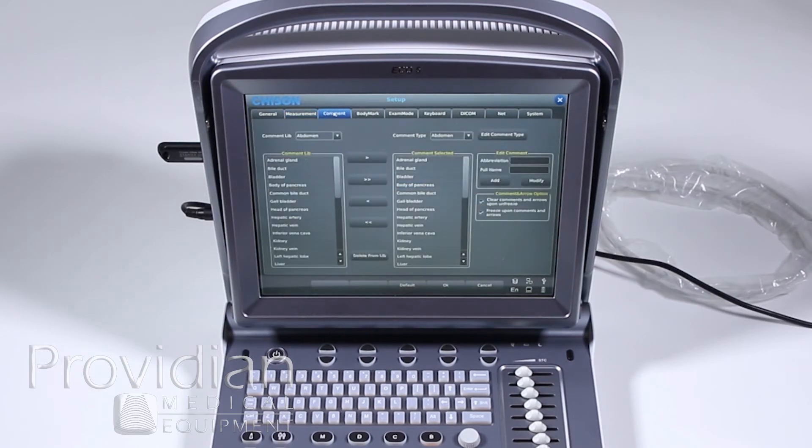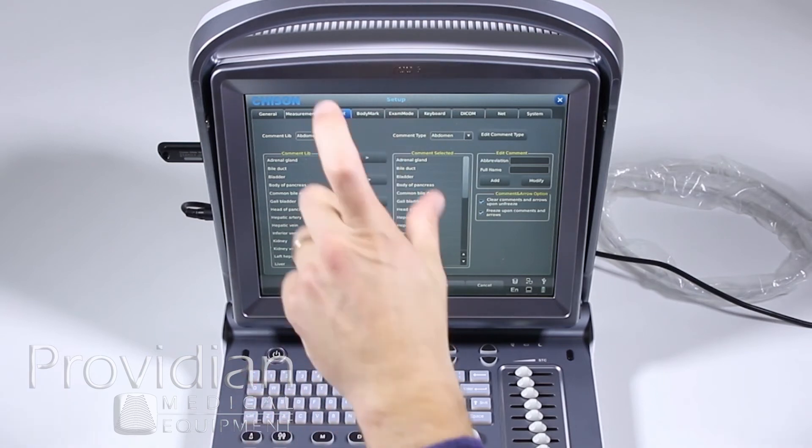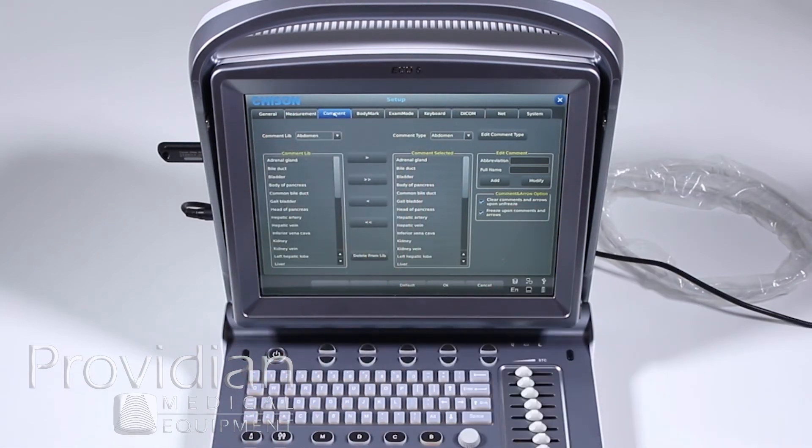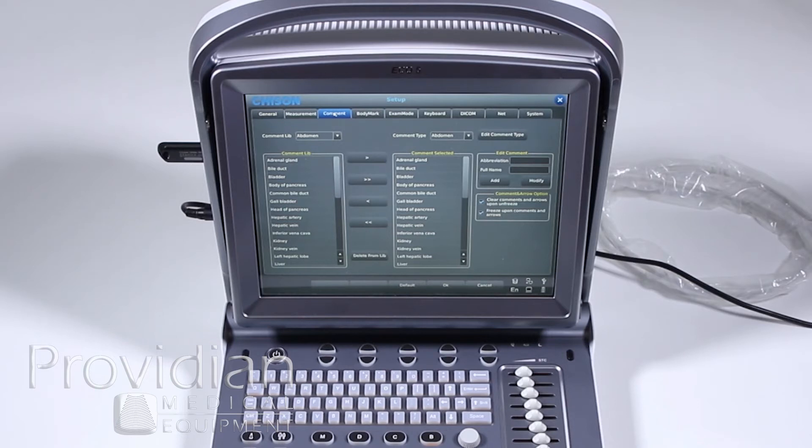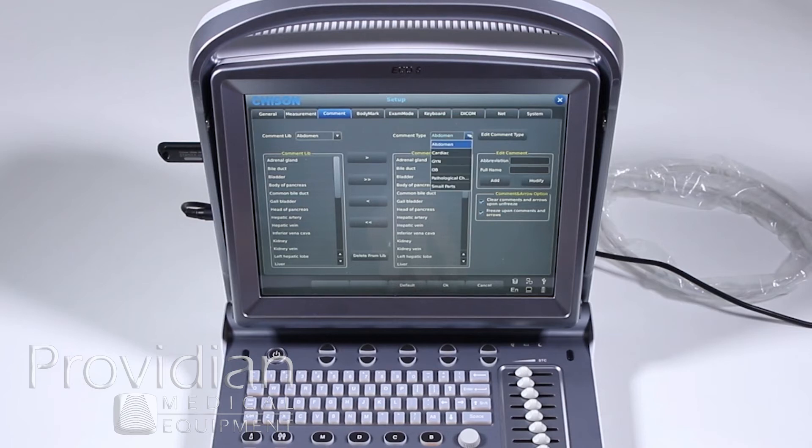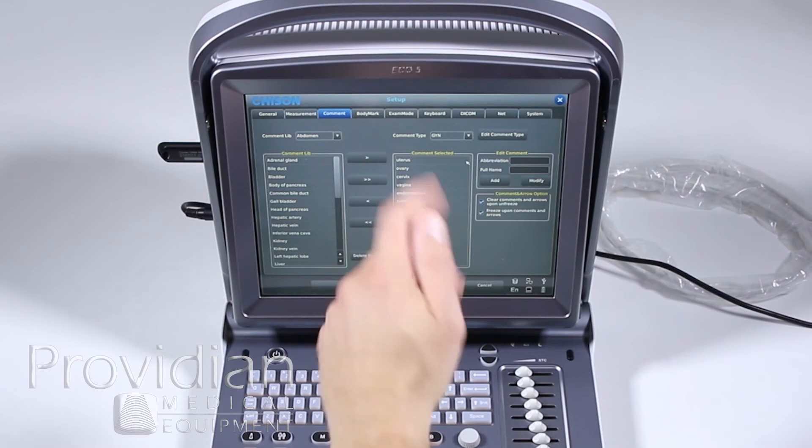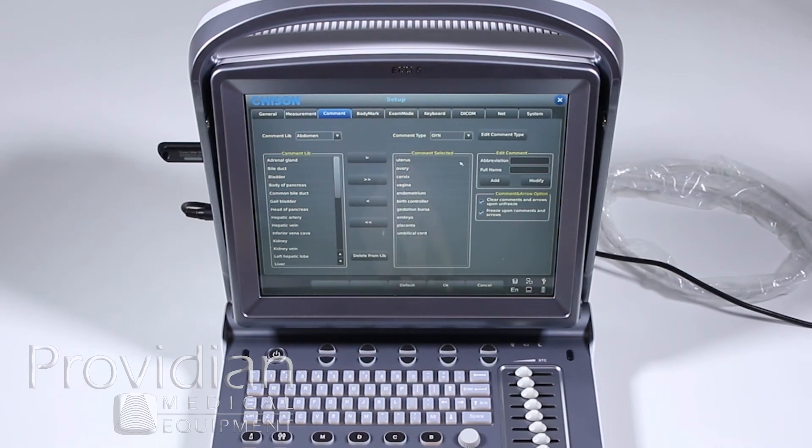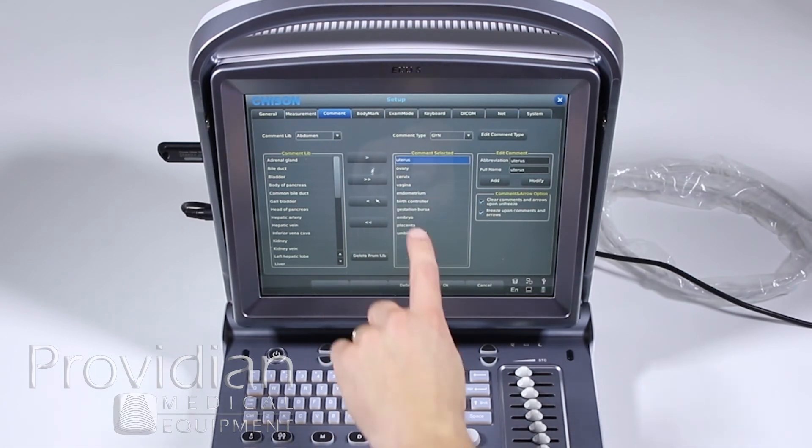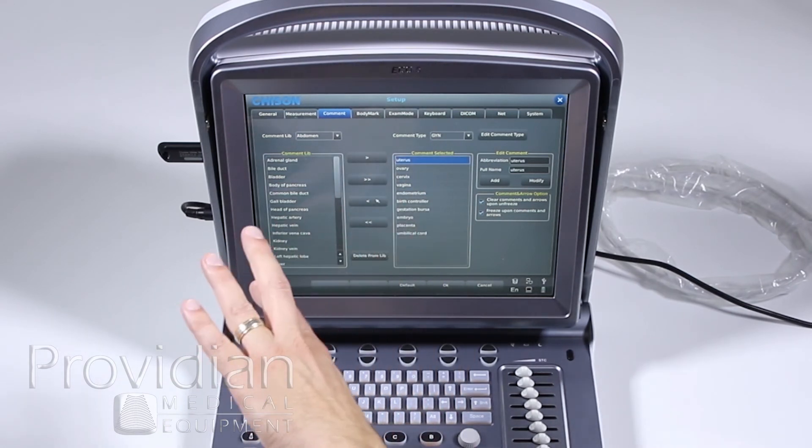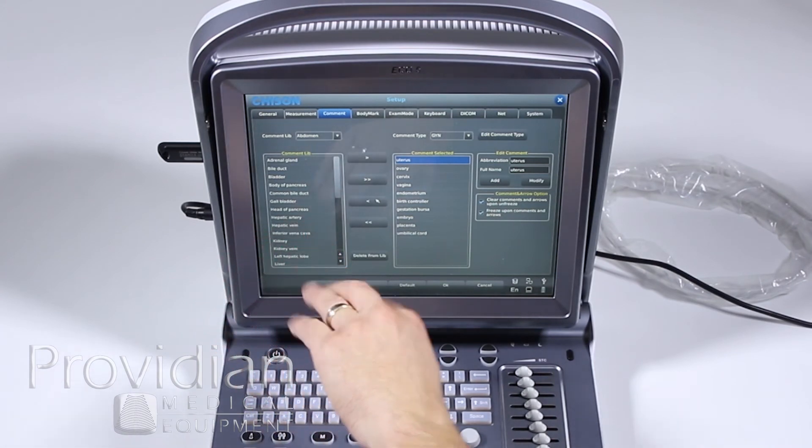Comment. Now we can adjust the comment libraries. When we hit annotations, it had that library pop up on the left-hand side. You can customize this to get rid of whatever items you want. So like when you go into the abdomen, let's say we went into the GYN and we didn't want all of these comments showing up.